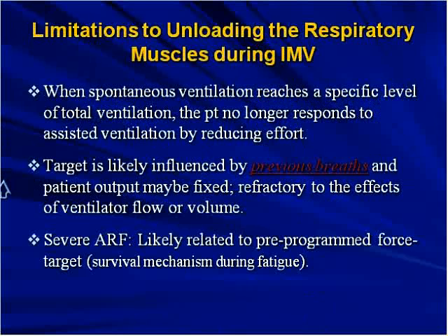And what this means is that when you have the SIMV rate set close to the patient's total spontaneous rate, it works well in reducing work of breathing. But when you start getting down to IMV levels of 6 or 4, again, depending on the patient's spontaneous rate, the mechanical breaths likely do very little to offload the work of breathing. And this is because the target output in terms of the patient's inspiratory effort is likely influenced by the previous breaths.